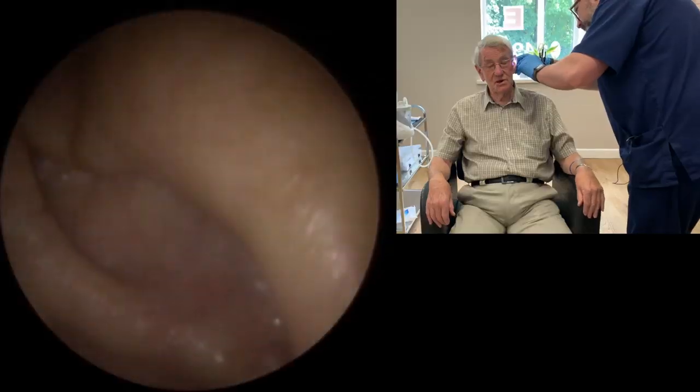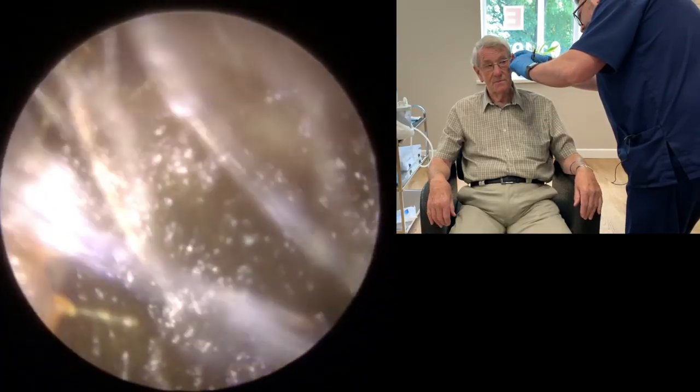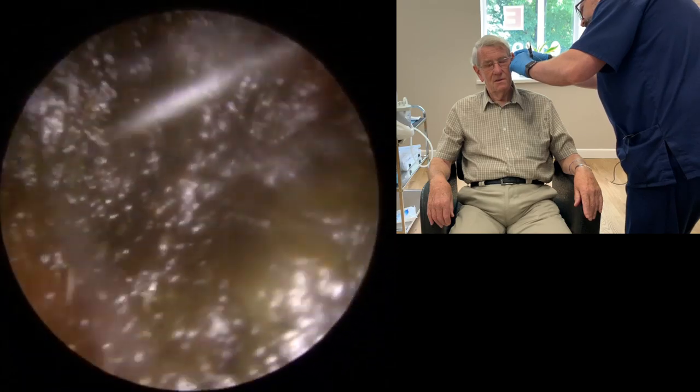Right, there we are, that's on now. So let's have a little look in these ears first of all. That's the worst, this one. This is the worst one. No problem, let's have a good look in here. Yeah, there's really soft wax in here, okay? Well, you've been oiling it for a fortnight, a week, man. Good man. Right, no problem.